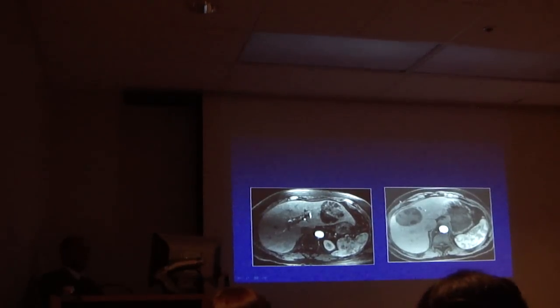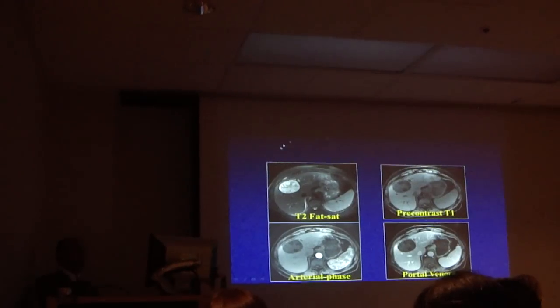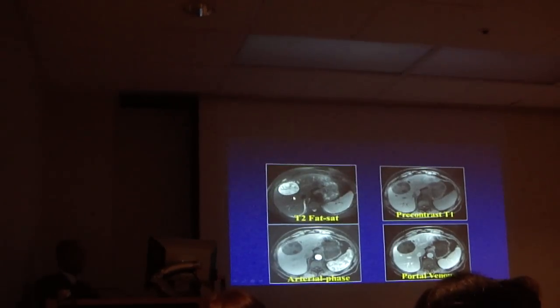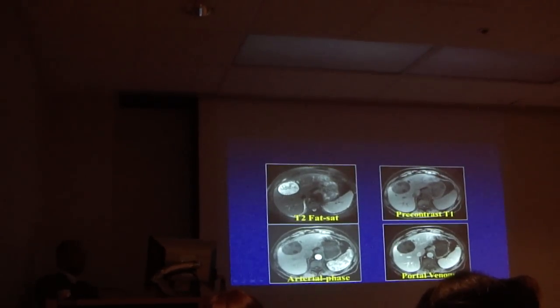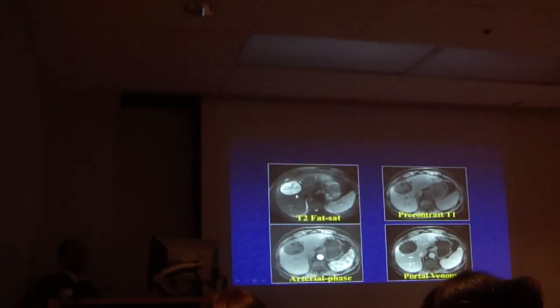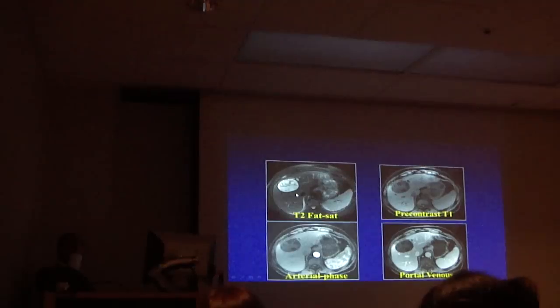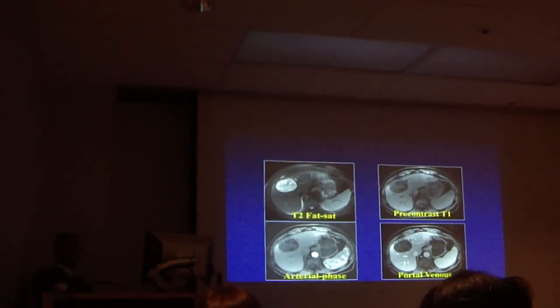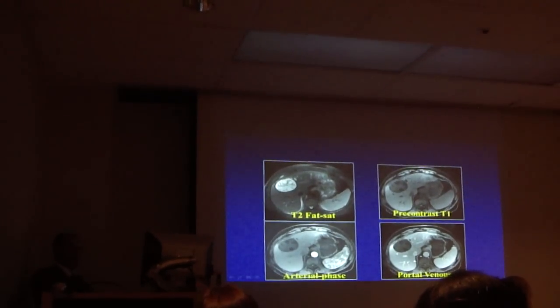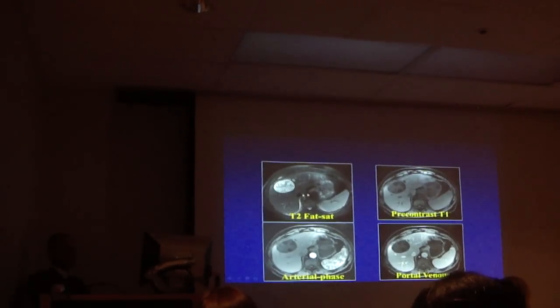Here's another lesion. Look at the septation within these lesions and multiple well-circumscribed locules. You could draw out the individual locules. Is there any washout? No. Multiple fluid collections — this is a parasitic cyst.